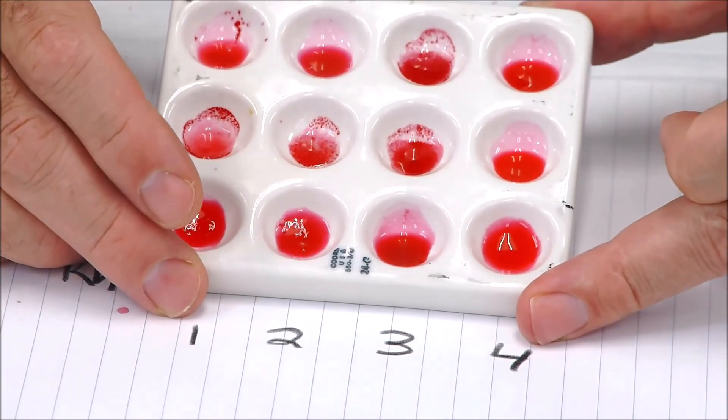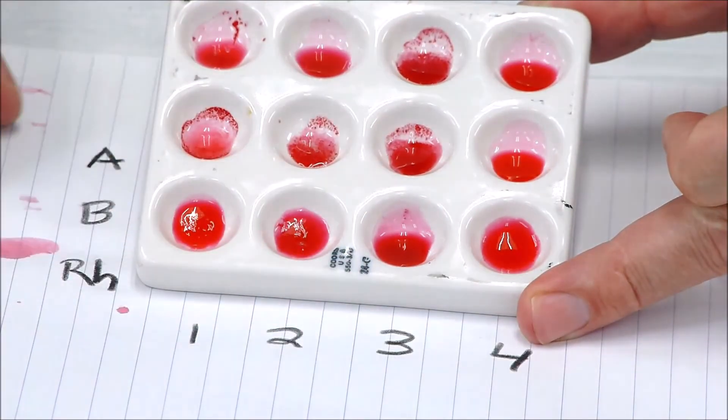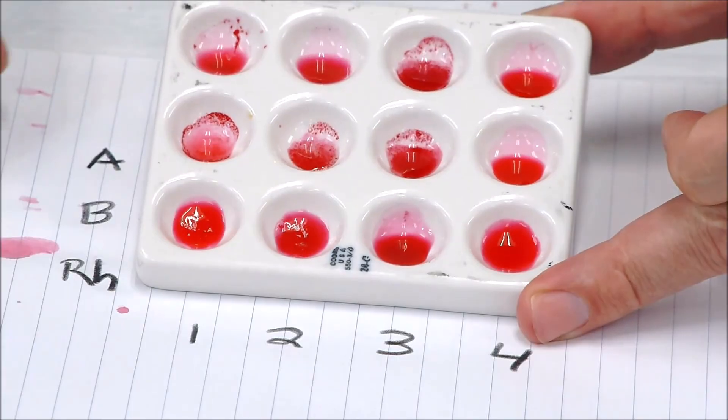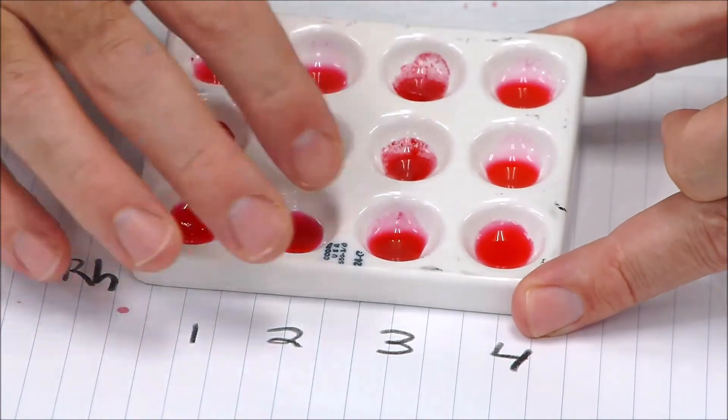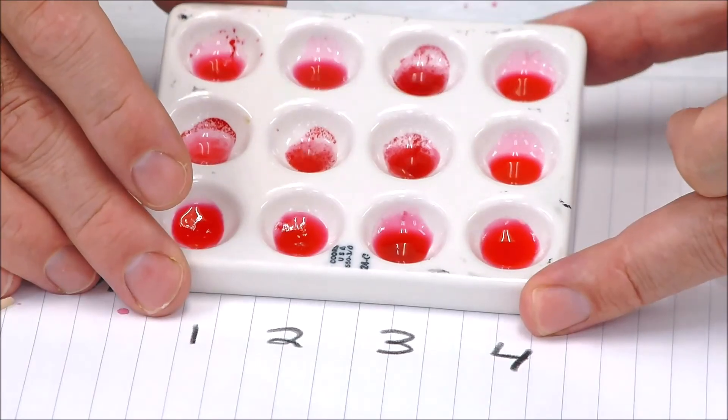For sample three, take a look at where we see clumping or agglutination. Okay, so this is sample three right here—this is well A, well B, etc. Okay, so what does it look like? And sample three doesn't have any clumping or agglutination in the Rh, so keep that in mind.